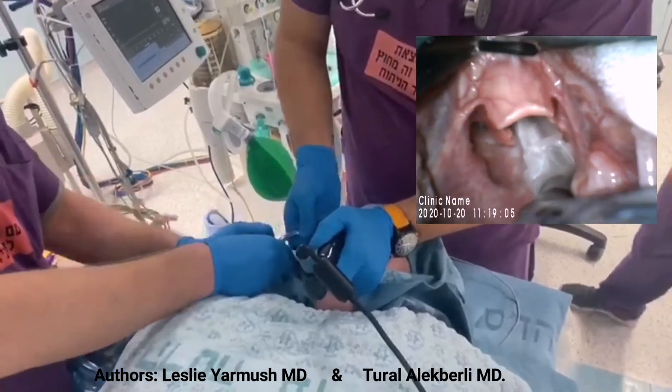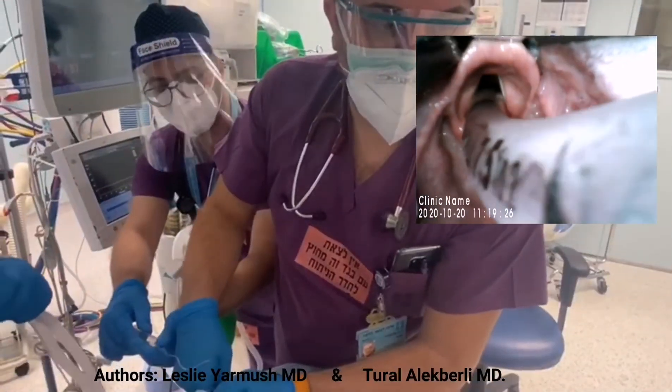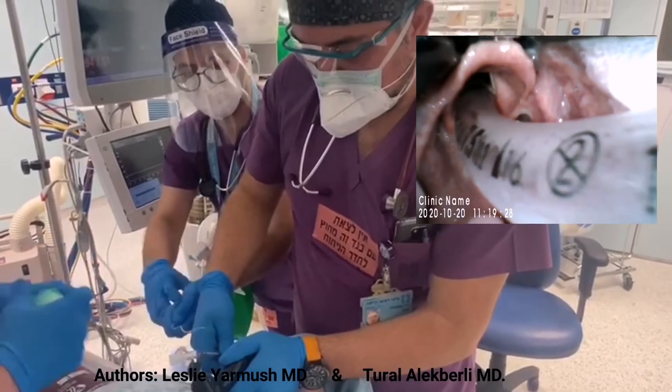No manipulation needed. After successfully intubating the trachea, we pull out the stylet and inflate the balloon.